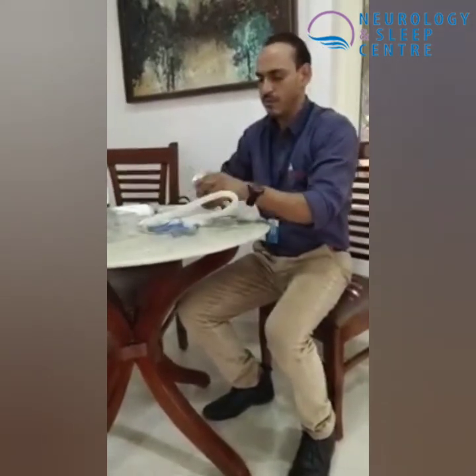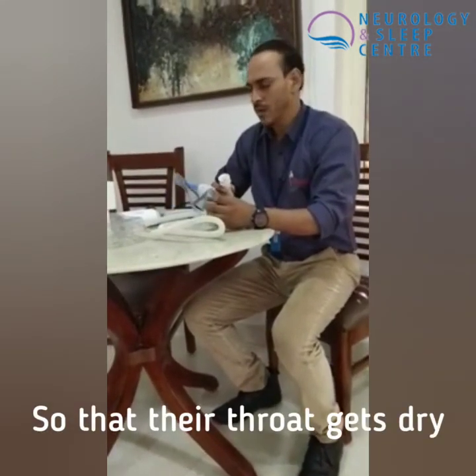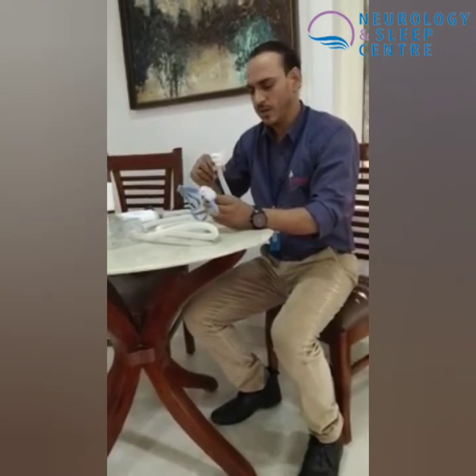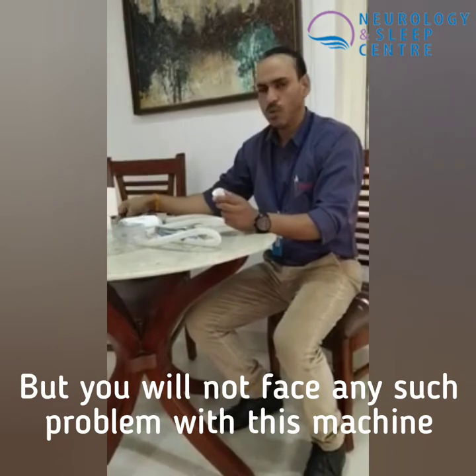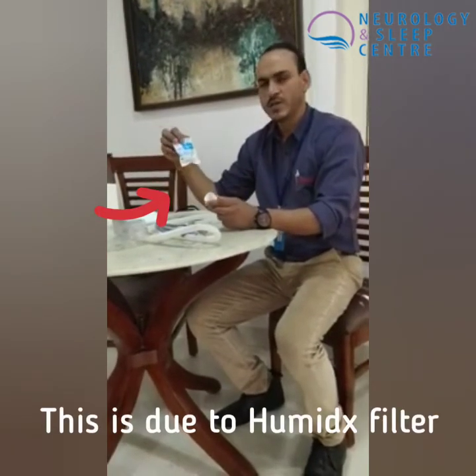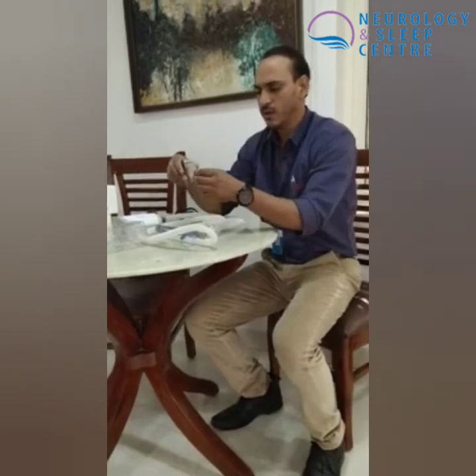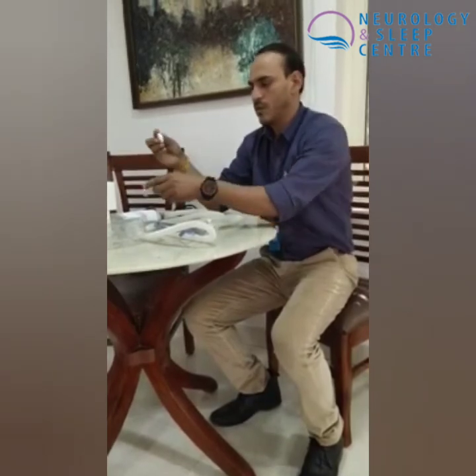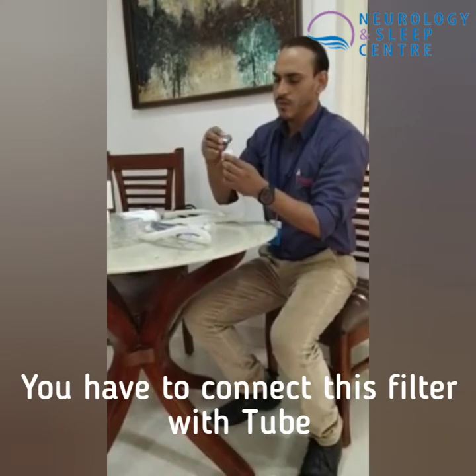Before putting the mask on, I would like to mention that all patients have a big issue of dryness, which can cause them to stop using the machine. But in this small machine, the company has made a system — this is a Humidex filter. There is a filter here. We can remove this filter, and we keep this filter in place.